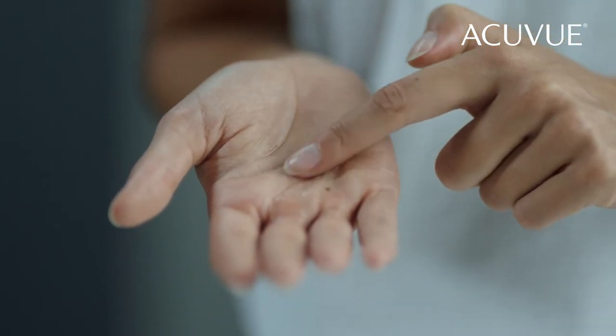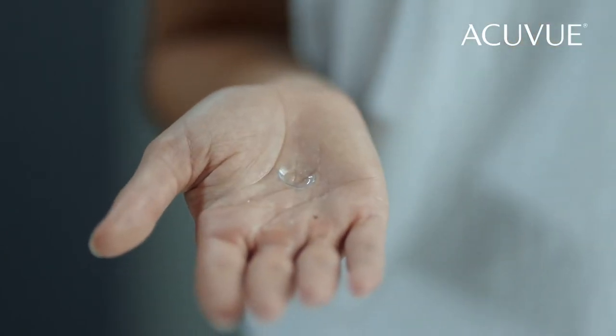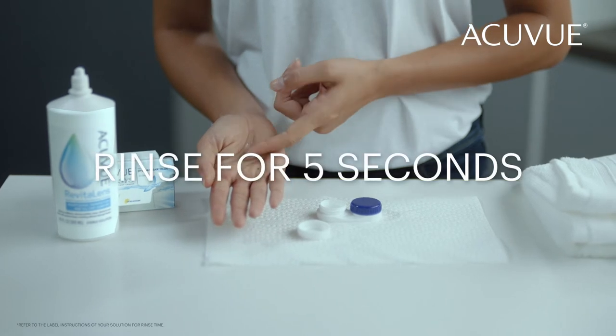Make sure you never rub in a circular motion. It could tear the contact lens and leave the edge unclean. Now rinse each side for at least five seconds with solution.